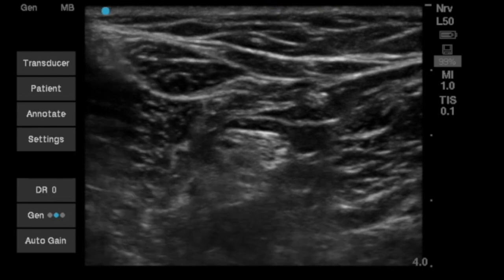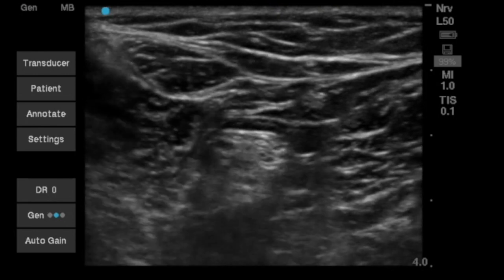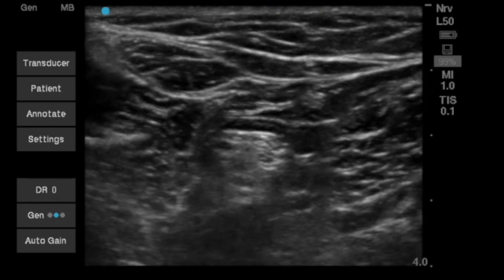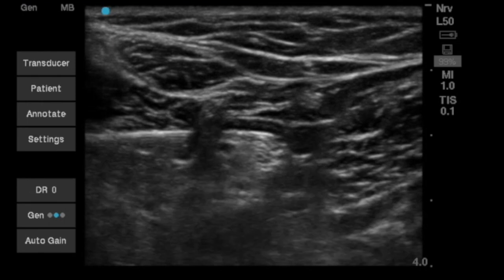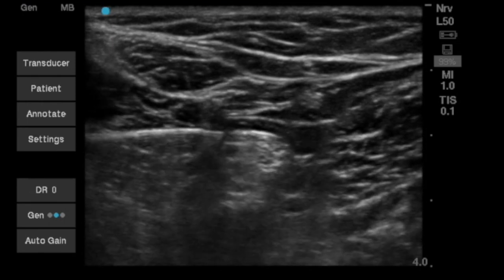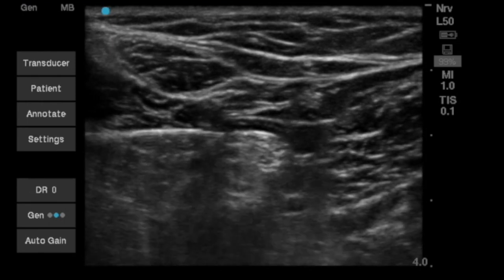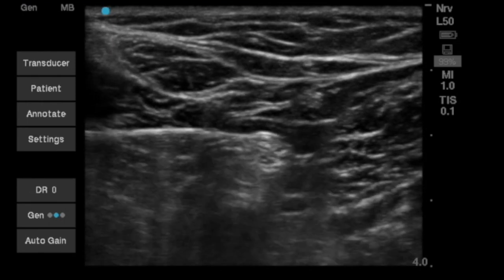Here, we perform a popliteal sciatic nerve block. At our facility, we tend to block the sciatic nerve just before the common peroneal and tibial branches separate.